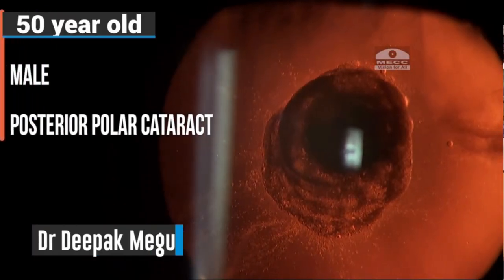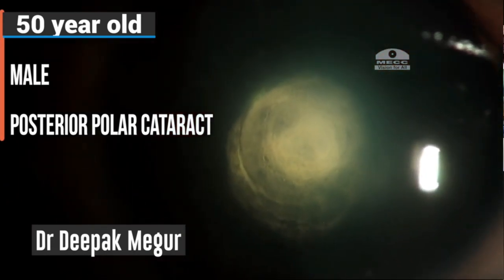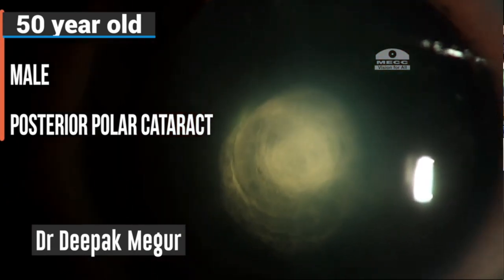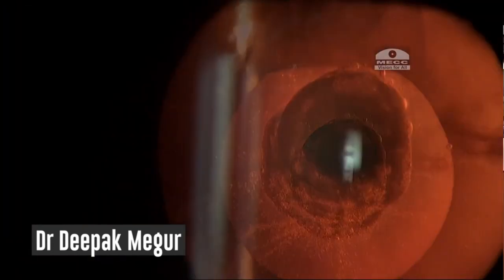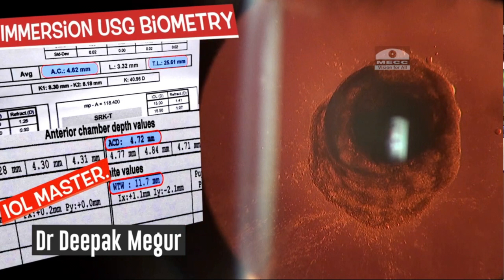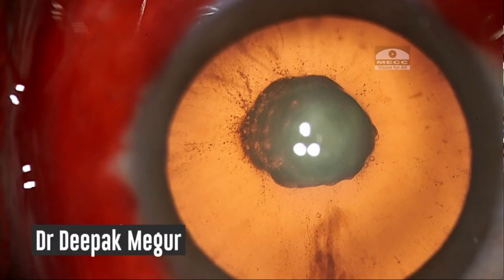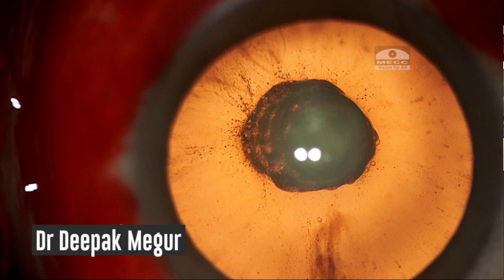This male patient has a posterior polar cataract. He has a classical onion peel appearance, and interestingly, the biometry shows a very deep chamber of 4.62 millimeters and an axial length of 26 millimeters. So let's begin the case. The surgery is being done under posterior subtenon anesthesia.